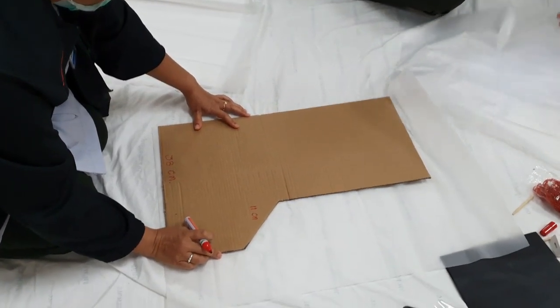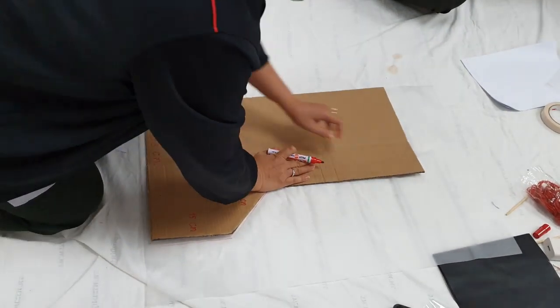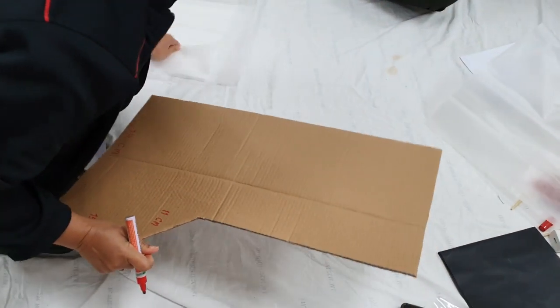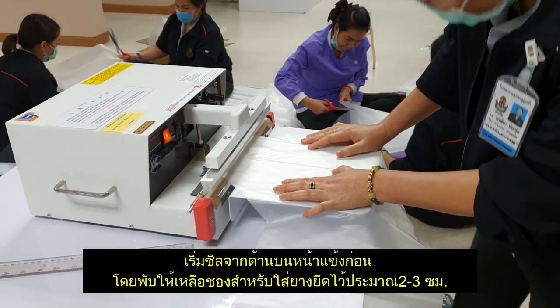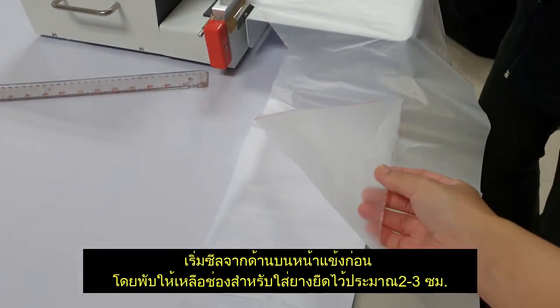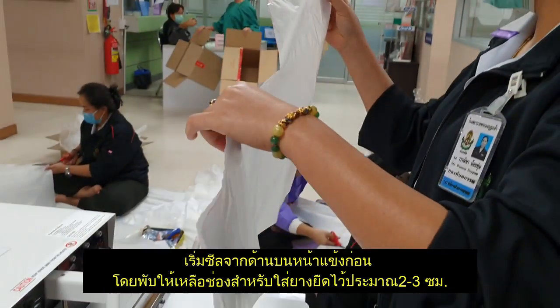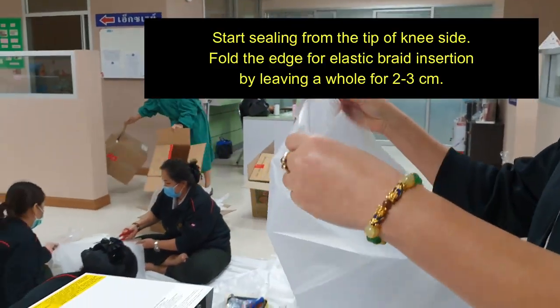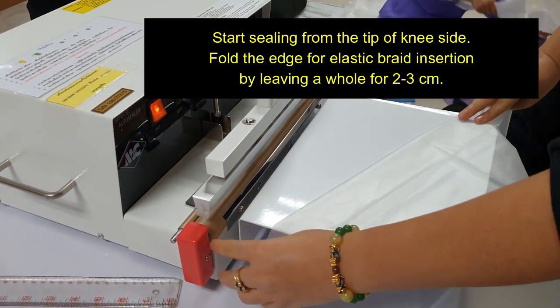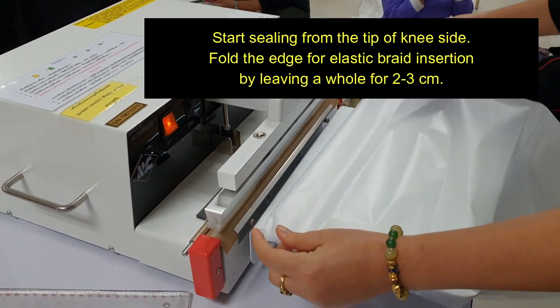For the first step, you have to cut HDPE bags with the size and pattern that we have already prepared. Just follow the line and cut it. This is the first piece of the pattern that we cut out.